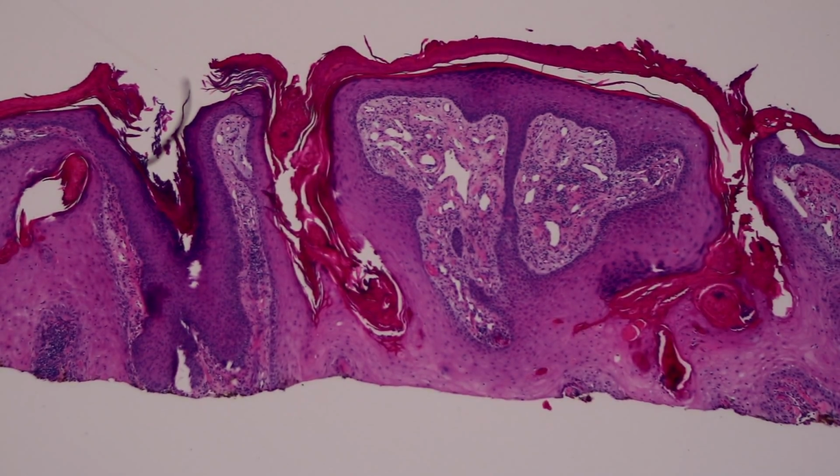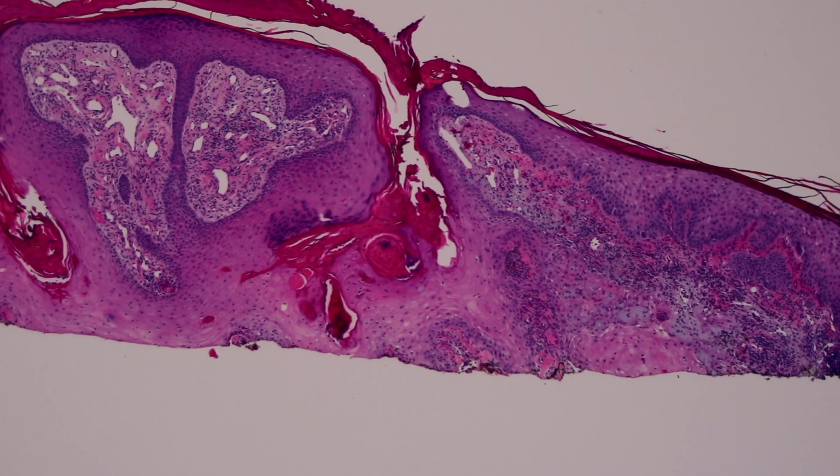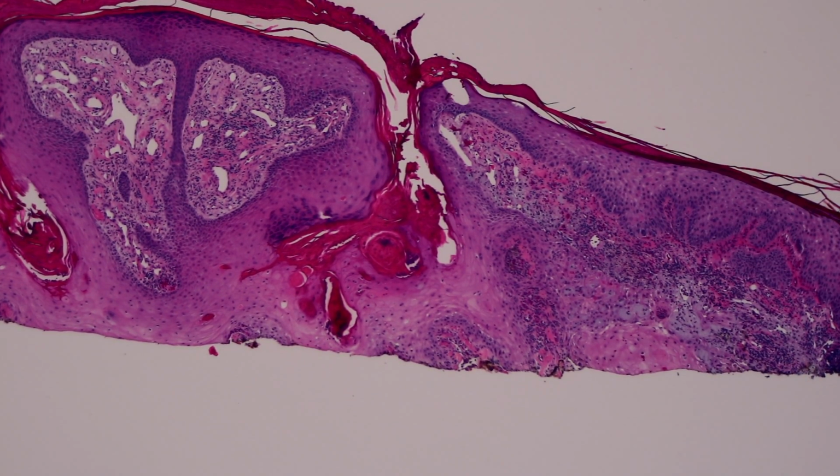And the reason I want to be cautious in a scenario like this is because sometimes reactive squamous proliferations can make this glassy expansile look, what we call pseudoepitheliomatous hyperplasia, or PEH. So pseudoepitheliomatous hyperplasia can happen as a reactive phenomenon from a ruptured cyst or from prurigo, from picking and scratching.